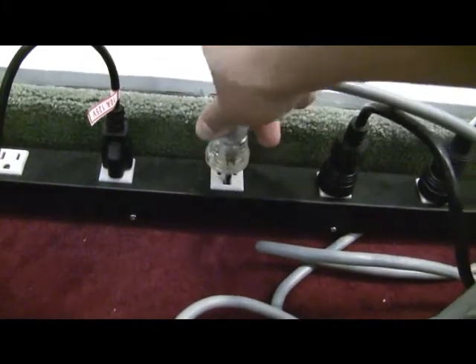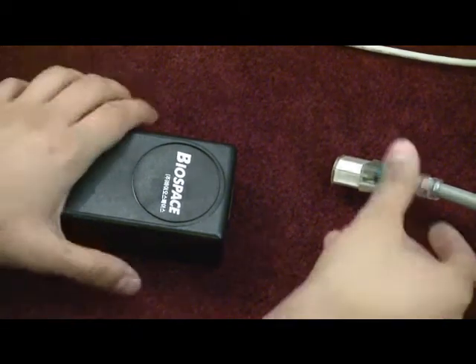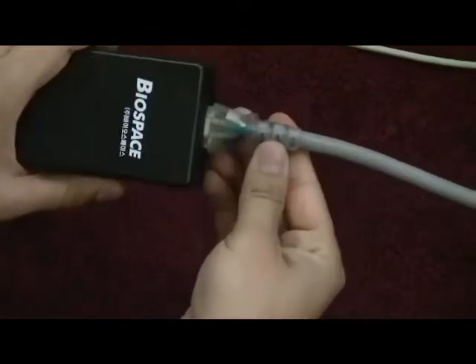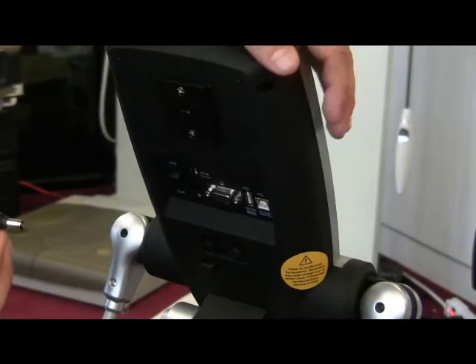Set up connections. Grab both the power cord and power adapter, which are packed in the box. Plug the power cord into the outlet, preferably on a surge protector. Plug the end of the power cord into the power adapter as shown. Make sure the power cord is plugged in firmly. Plug the power adapter cable into the InBody.